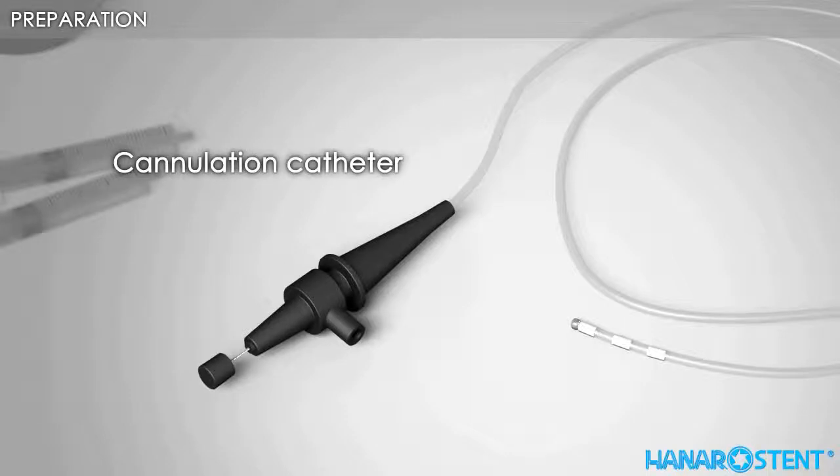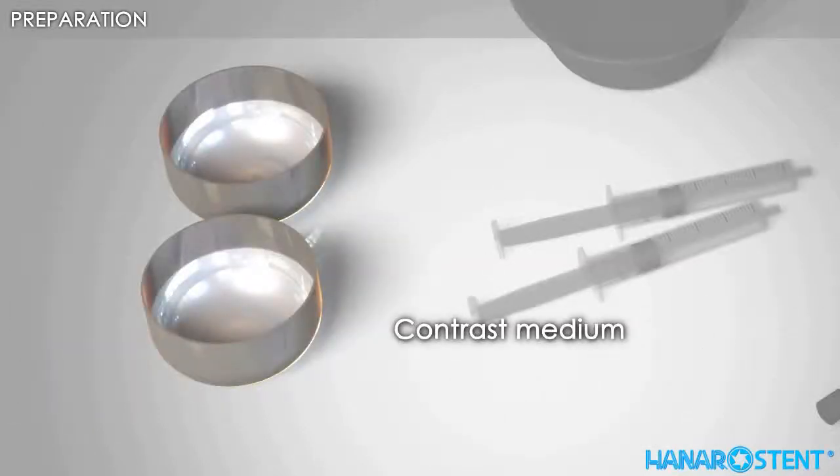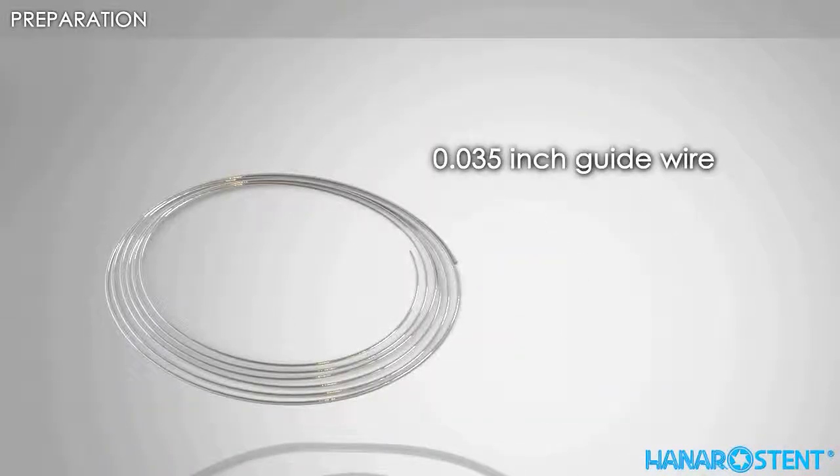Here are the necessary tools for a stent procedure: a cannulation catheter, a 20cc injector, contrast medium, saline solution, and a 0.035 inch guide wire.